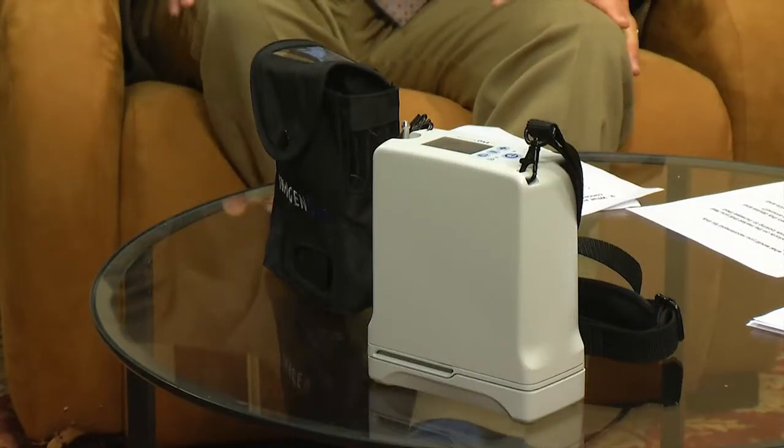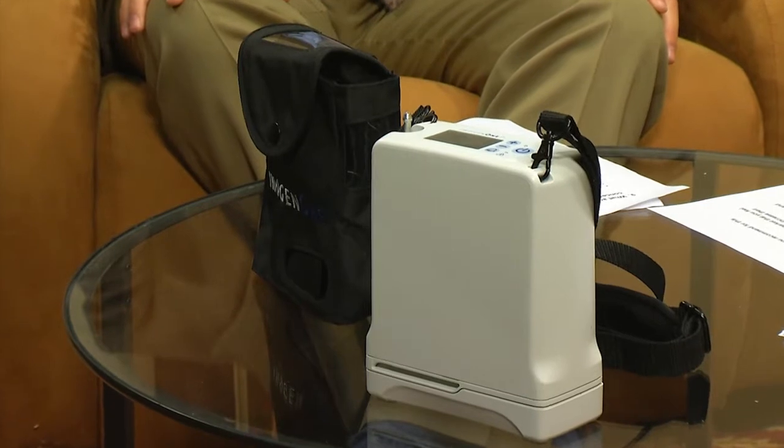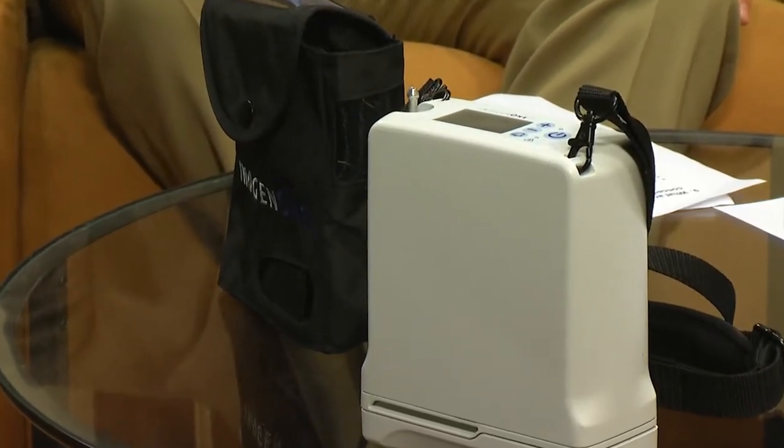There's a lot of oxygen concentrators, that's what we call them. They're machines, like I said, that manufacture oxygen out of the air that we breathe. Those machines can be anywhere from 40 pounds. They're called stationary units. They sit by your bed or somewhere in your house with a long nasal cannula, a tube, so that you can breathe the oxygen. You cannot take those machines out. They're plugged into the wall, and that's where they are. And those are the kind of machines that require a tank. So if you want a small tank, if you need to go to the doctor's office or shopping.